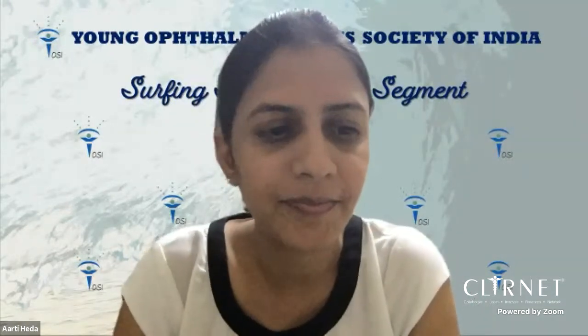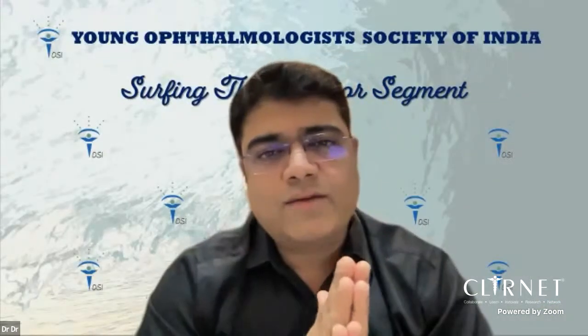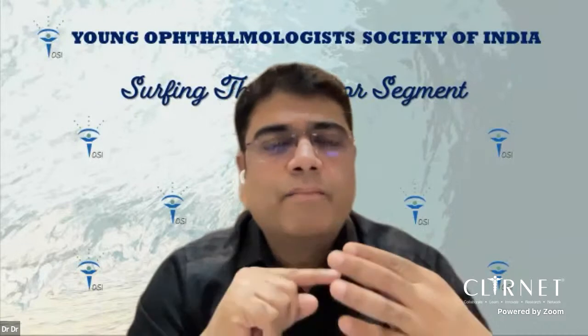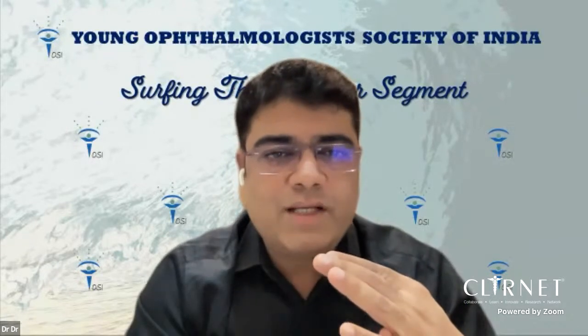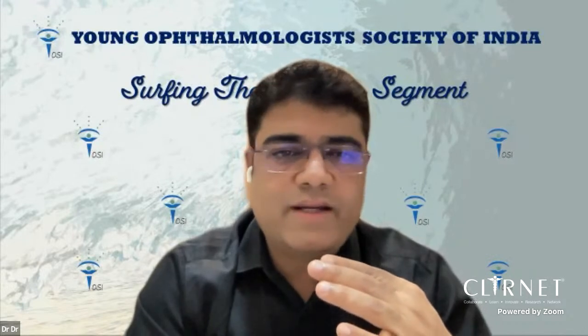One more thing, for the beginners, would you suggest that all the anterior segment surgeons should know pars plana vitrectomy, or is anterior vitrectomy good enough to manage these kinds of cases? See, it depends on the type of setup where you are working and the type of training which you have undergone. But if you follow the basic principles, you can get away with limbal vitrectomy also and through pars plana also.